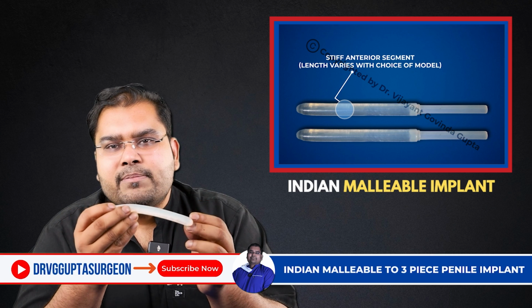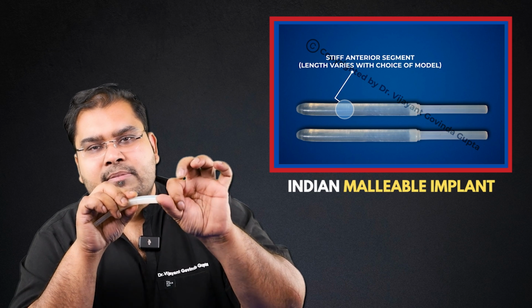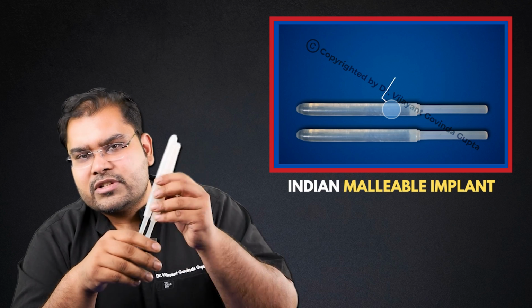But even if some patient is old, is diabetic, and there is no blood supply at all, these implants in themselves are enough for penetration. The patient can put it inside the vagina and have sex. Two of these make the penis pretty stiff and they are good enough for sex.